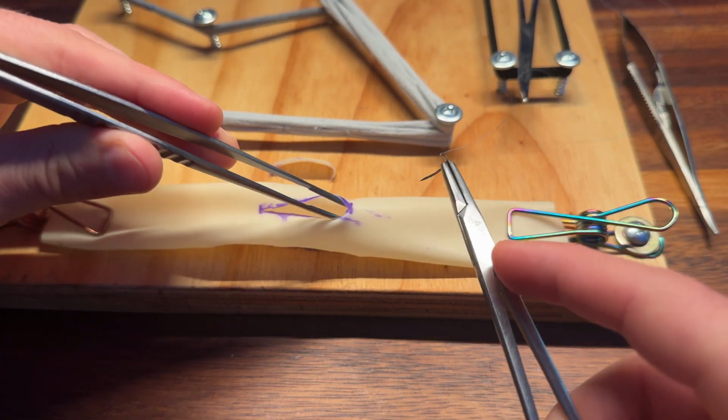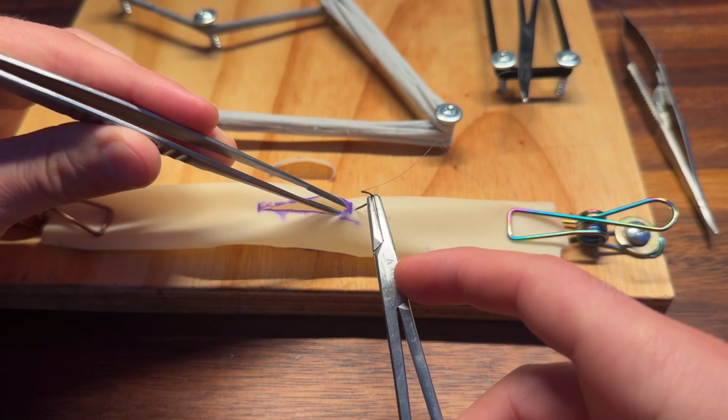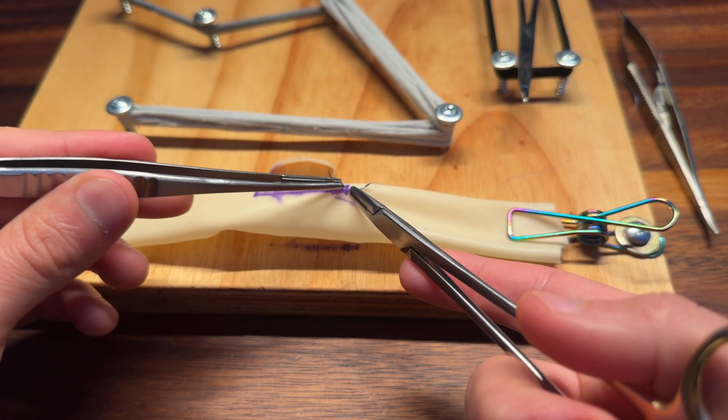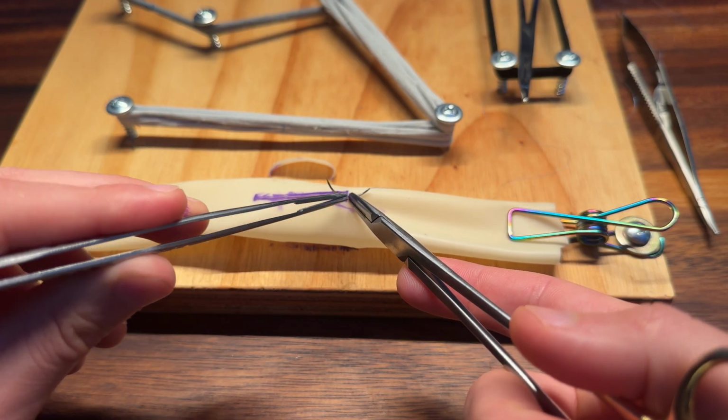So here's the technique that I've seen, where you open this up with a DeBakey forceps, and then you pass the needle in between, right? That way you're not damaging the blood vessel. The very first throw is going to be from outside to the inside of the blood vessel at the apex, okay?